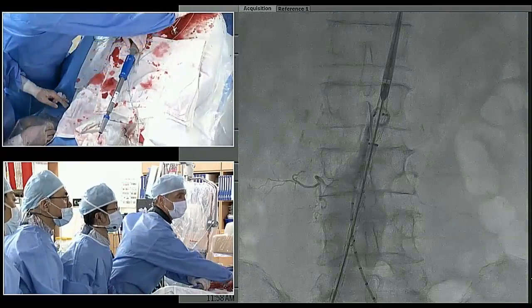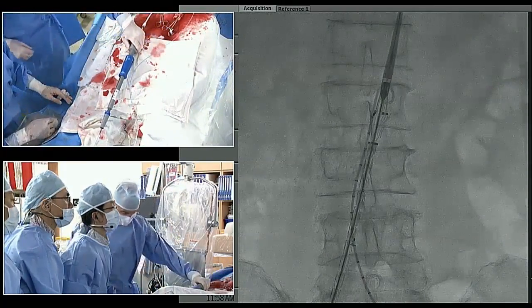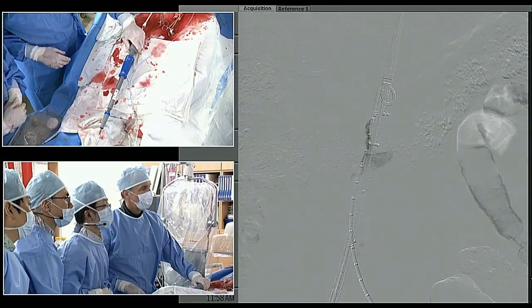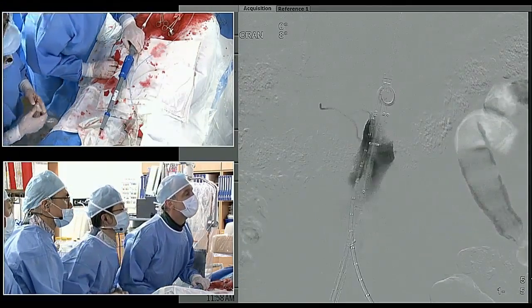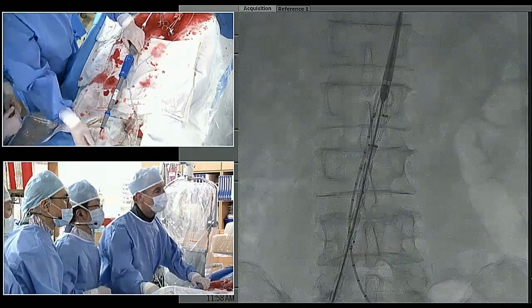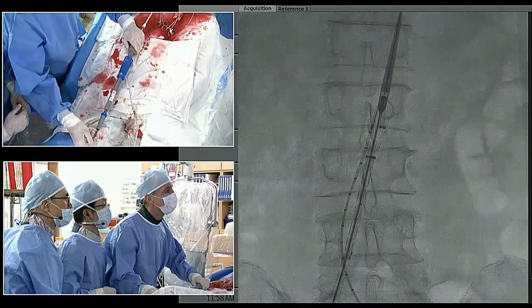Yeah. Push this up. Yeah, we presume you have an overlay roadmap or the screen's being marked for you. It's not, but we could use that. Might still be just slightly high with the fabric. It's a little high. Yep. That's okay. You can start a little high and pull back. I like that right there.